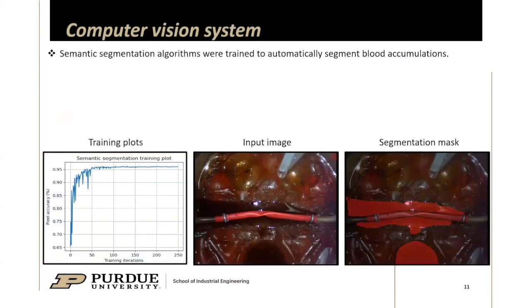As a computer vision system, we developed semantic segmentation algorithms that were automatically trained to segment blood accumulations.